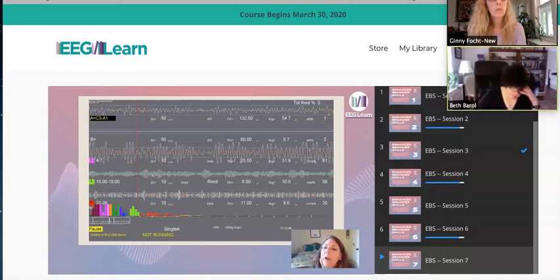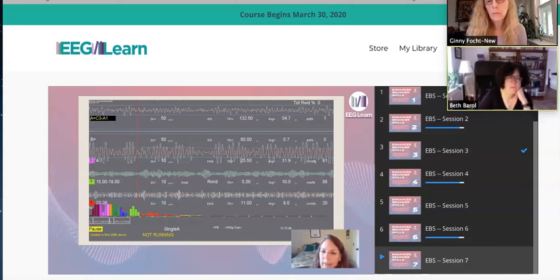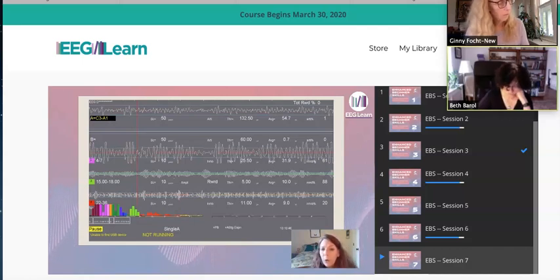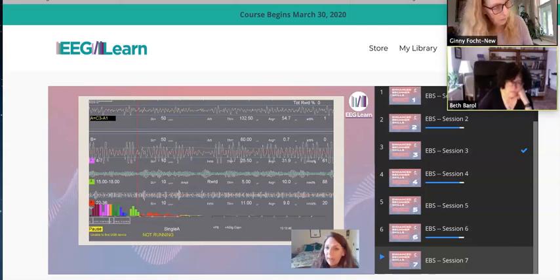So we said a 25% inhibit is a moderate challenge level on the 22 to 36. I'm loosening it up a little bit because I want to put all the emphasis of my training on getting that slow wave down. So again, the percentages can help you know where to set the threshold in microvolts, but you can also just look at the microvolts and the average amplitude.